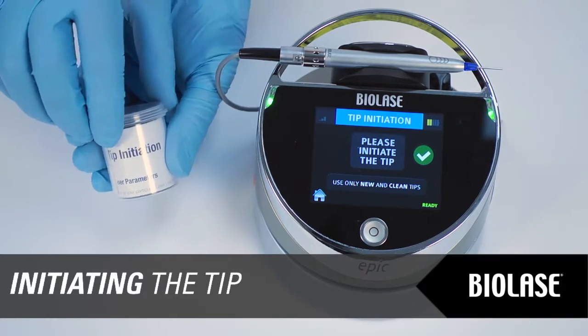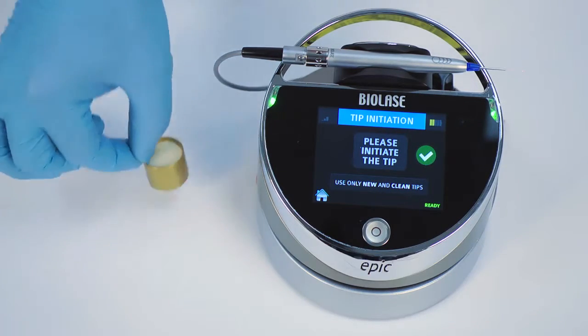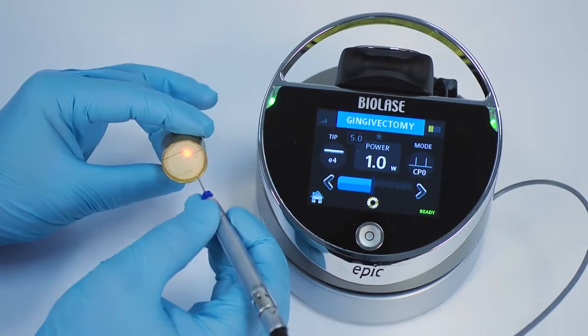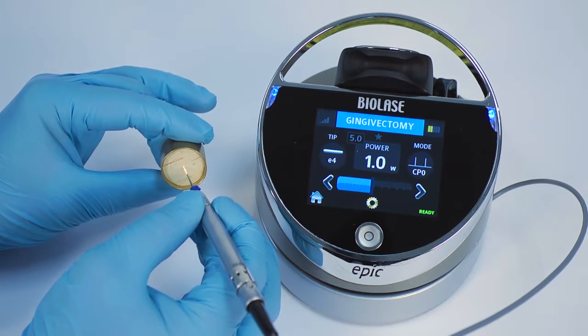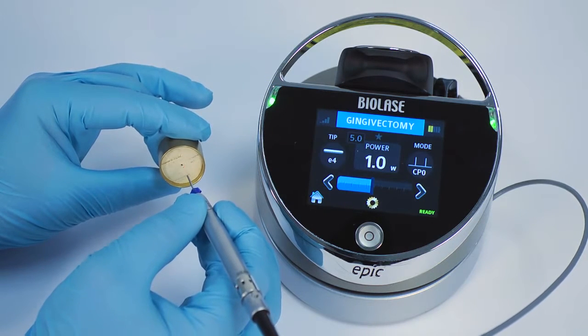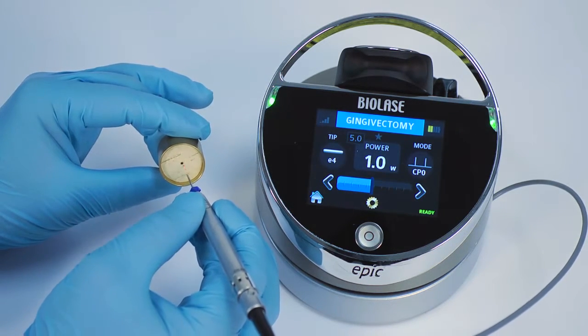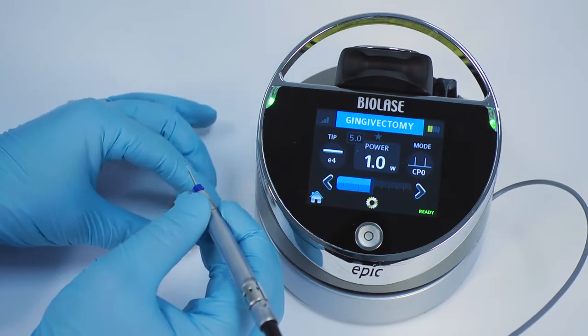First, open your tip initiation kit and remove the initiation block, which is a small cork. Touch the Epic tip to the surface of your initiation block without firing the laser. Next, fire the laser, allowing the tip to sink into the block. Count 1, 2, 3. Pull the tip out of the block, count 1, 2, and stop firing. At this time, the tip should be out of the block.